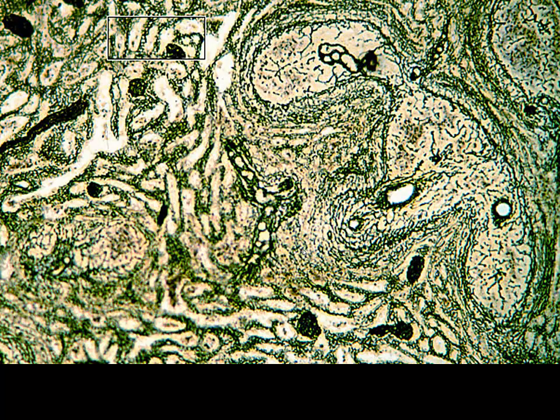Now, for these next couple of slides, you've eliminated the soft tissue, the cellular component, and we're just looking at the reticular fibers, the collagenous network that is left. And in this image, you can see the white pulp. You can see the central arterioles around the white pulp. And out in the red pulp, you can see where we're going to have those splenic or venous sinuses. It's really kind of a neat picture.